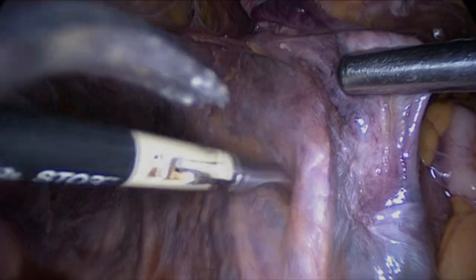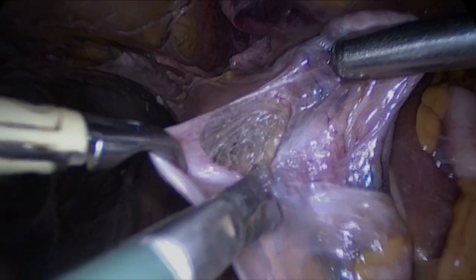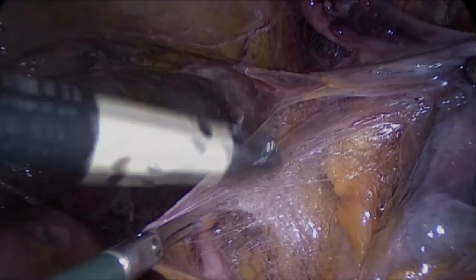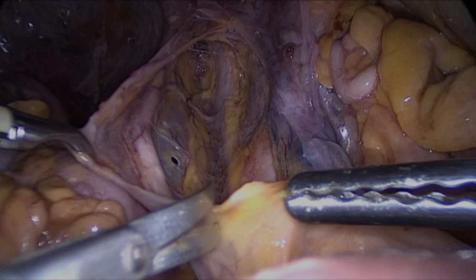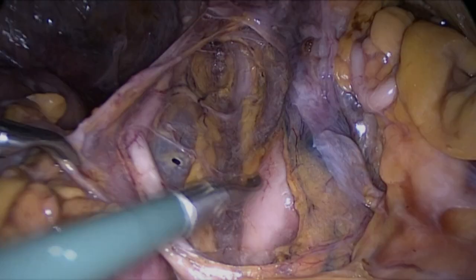So now that we have dealt with our adhesions and reviewed our pararectal and paravesical spaces, let's move on to our dissection. We should begin the dissection at the bifurcation of the common iliac vessels in the pararectal space. The first step is to make an incision medial and parallel to the infundibular pelvic vessels. As you can see, medial traction on the peritoneum is aiding in our dissection with laparoscopic scissors. Not shown here is that the dissection should be continued cephalad until the bifurcation of the aorta is reached.